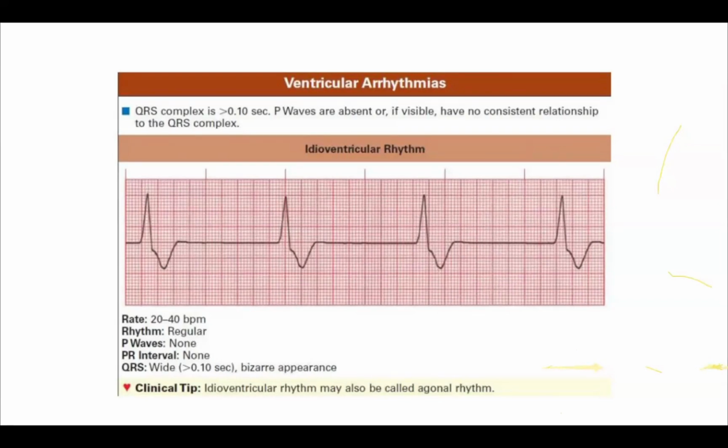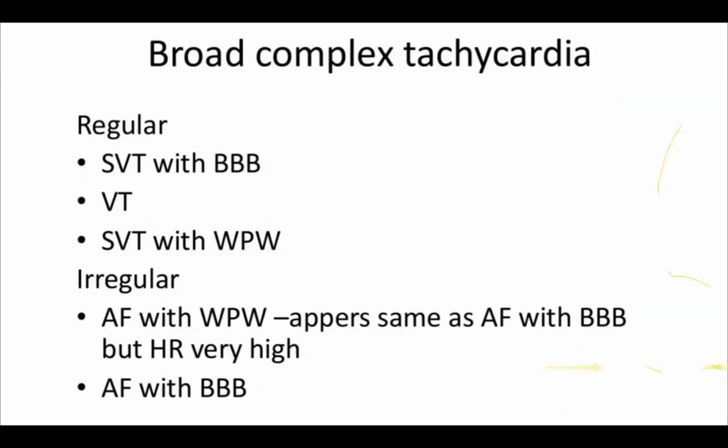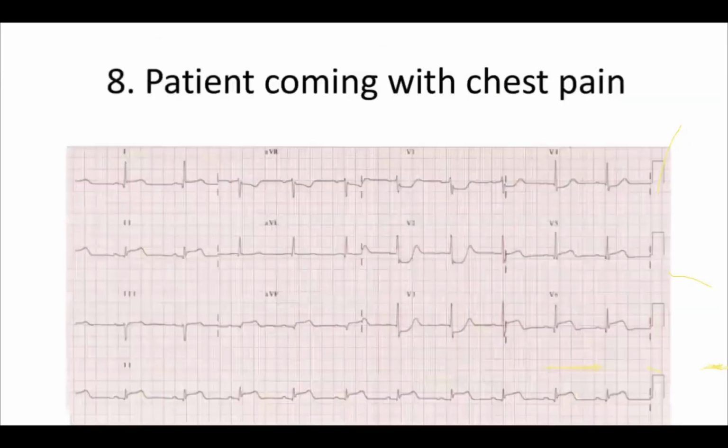So as a registrar, if you get a bradycardia patient with a ventricular escape rhythm, that patient is likely to be having an unstable rhythm, right? But if it's a nodal escape, usually the node is stable. So just remember that. So how will we differentiate? In a nodal escape rhythm, the node is the place where the ventricular impulse originates, so the QRS complex will be normal. Only difference is you don't see P waves, and then it is slow, right? This is just theory. I don't want to burden you. We'll discuss the ECGs, right?